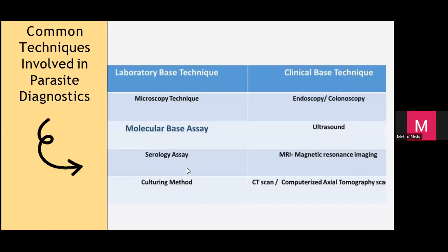Okay, untuk parasite how we use? This is common untuk blood related parasite. Untuk malaria, for example, we have pan malaria test kit. You take our human blood, okay, kita spin, we take the serum and we put in the kit. Sama saja macam how you do your COVID test kit lah. Kalau dia ada 2 band, okay, patient is positive.